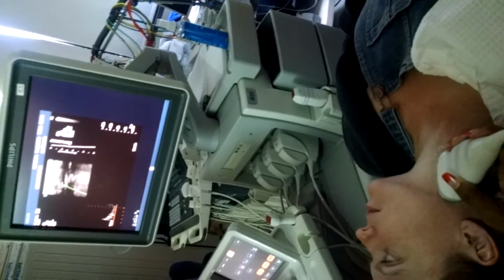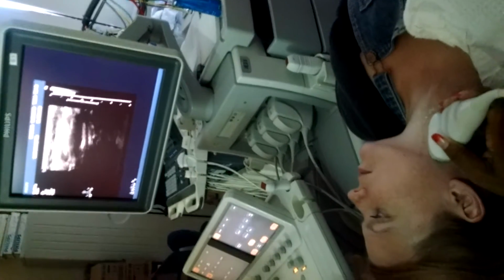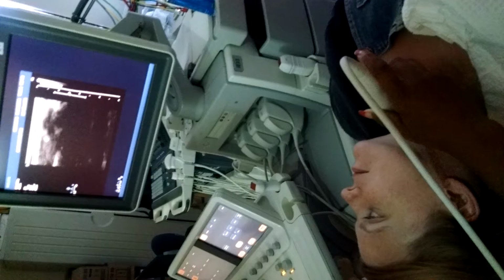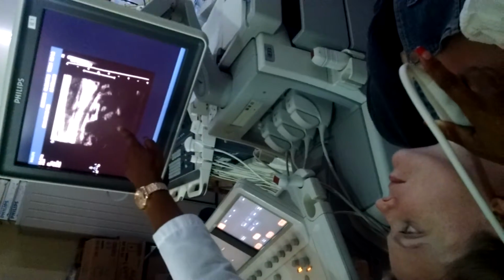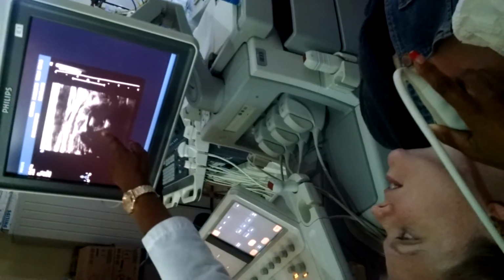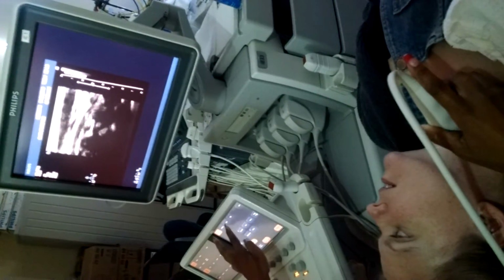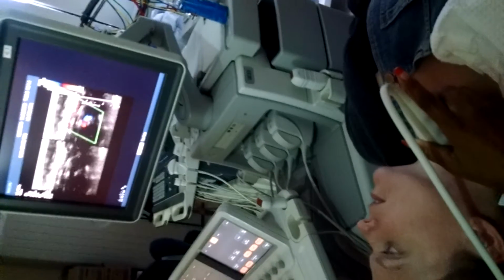Okay. Can I get the 2D? So I just take a transverse. I see if I come more anteriorly, because the vertebrals sit really posterior, if I shoot my beam from anterior to posterior, I should start seeing some vertebral processes, and there's the vertebrals. Easier to see with color, right? Yeah, but you have to be able to identify them with B mode first.